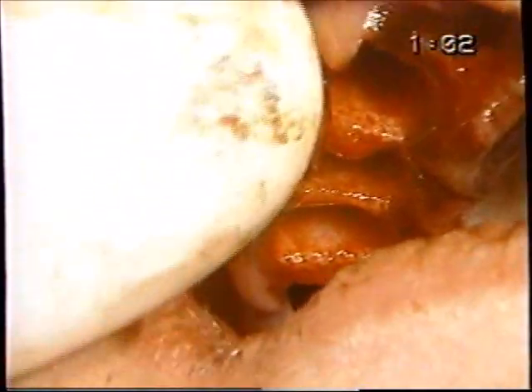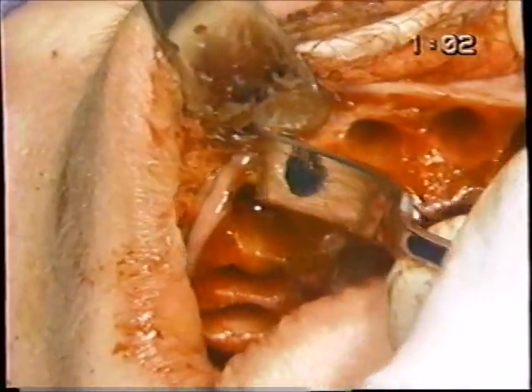Basically what I'm looking for here is that the bone is smooth and blunt, maybe is a better word, when the tissue is over it, and I feel with my gloved finger. I don't want to remove a lot. I'm not looking for primary closure. I just want there to not be areas of irritation with the denture. After some smoothing is done with the rongeur, some of the major areas, then we go in and just fine-tune it with a push-pull bone file, which is the 2X. Hufredi is the brand that we're using. You don't need to remember which way it works. You can go either way. We need to make sure that after we do this, we profusely irrigate and not leave little pieces of bone in there.